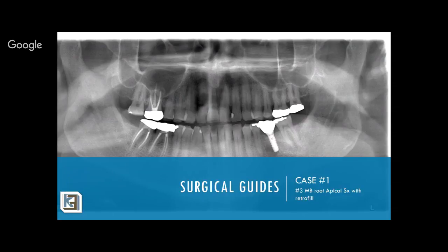The Sirona machine seemed to be very simple for my staff. The patient just bites on a bite plane, sticks their head in there, the machine centers the patient, and you just press a button and you get the scan. My experienced staff who used to take my CT scans had left, and it was time for me to upgrade my CT scan machine, and that's when I started looking at the Sirona and I got that one.